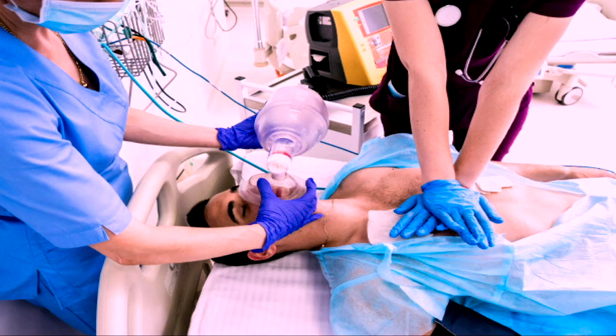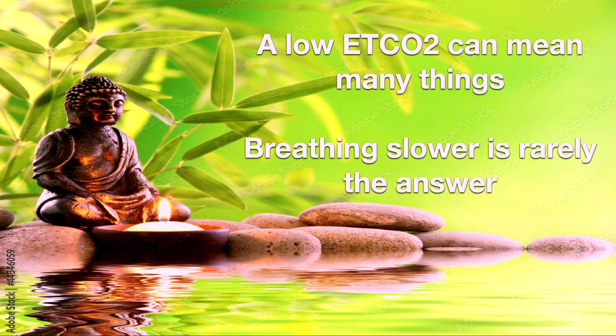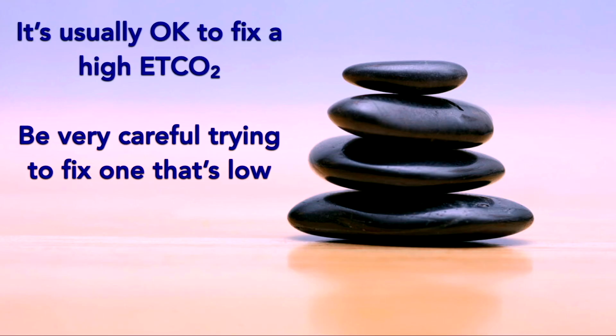The carbon dioxide level in their blood is at least as high as what they are breathing out, but it could be significantly higher, and that's where you have to come in as an excellent clinician and be able to make sense of these. So a low end tidal CO2 could be a whole bunch of different things, and breathing slower is rarely the answer. Not never the answer, but rarely the answer when you notice it.